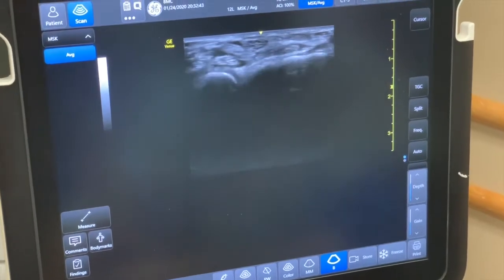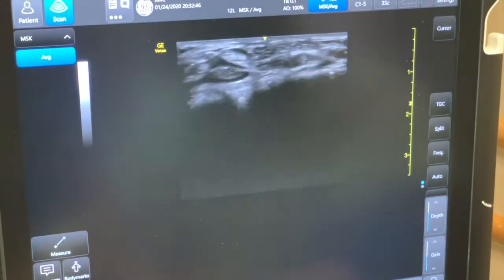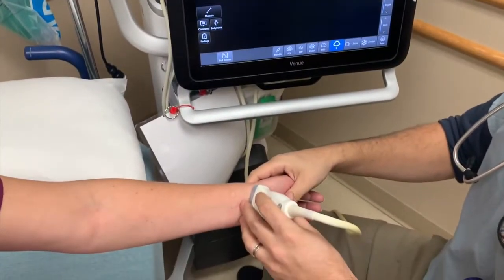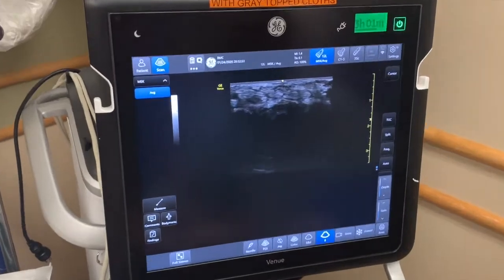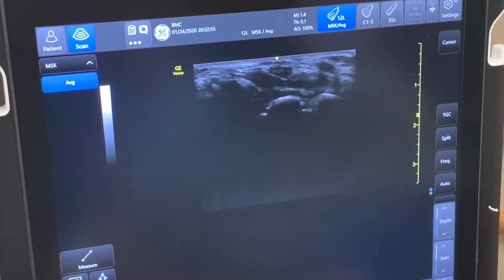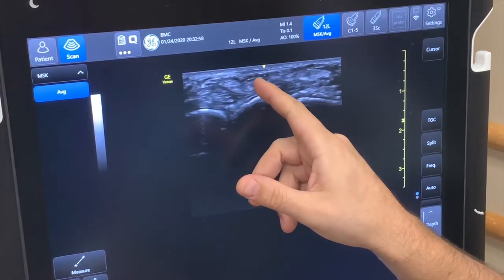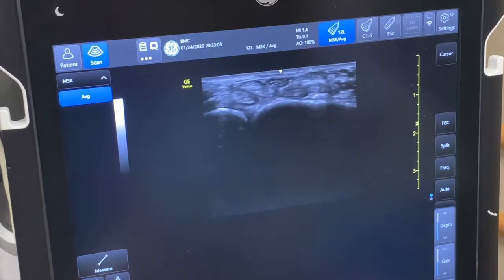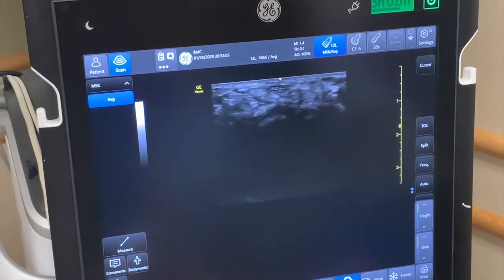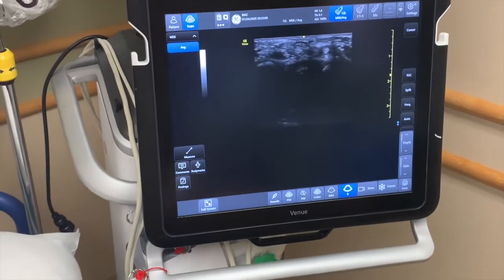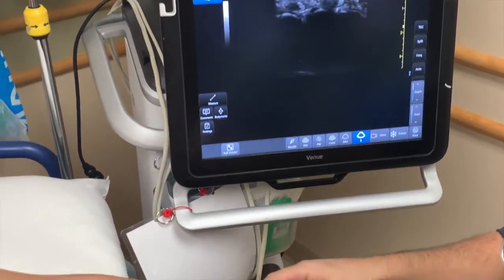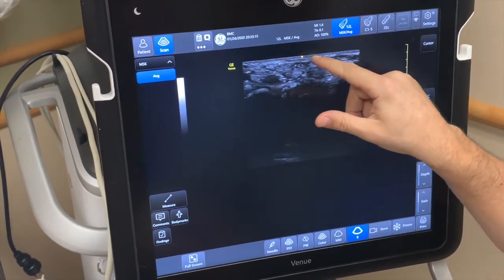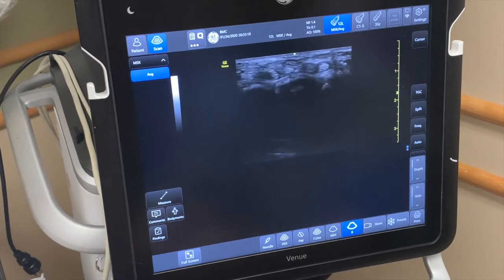Moving medially, here in the middle of the screen you'll see a tendon bundle and the median nerve together. This would be the median nerve here in the middle — if you were to follow that up the forearm, it would go deeper. If you're looking for septic tenosynovitis, you'll look for basically a fluid collection completely surrounding the tendon bundle.